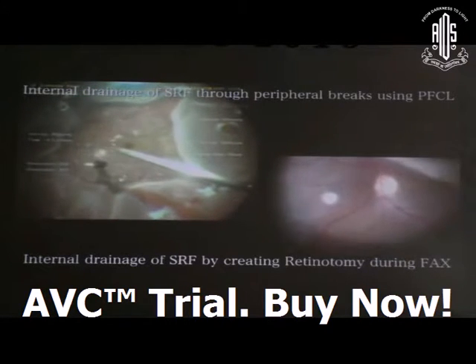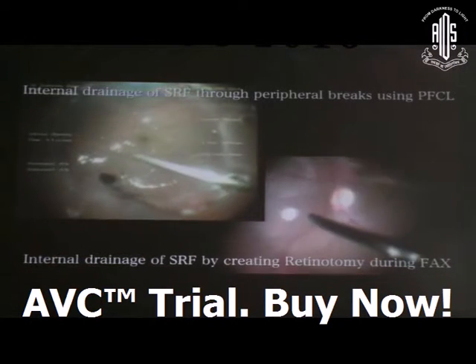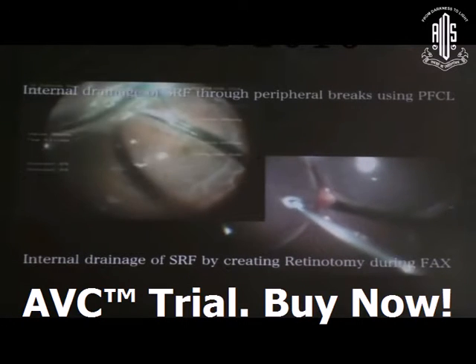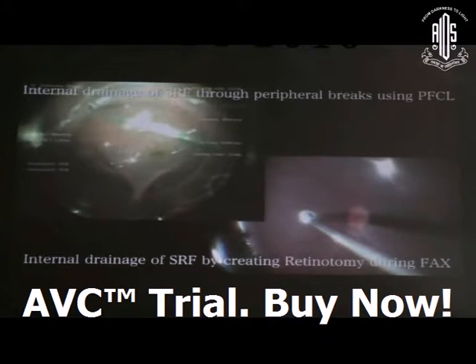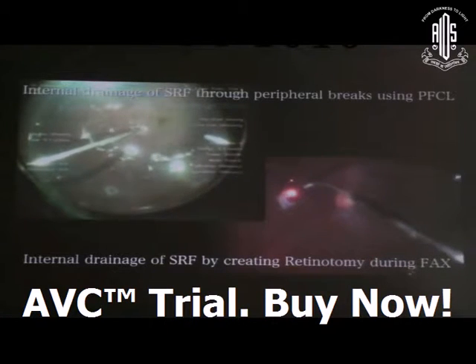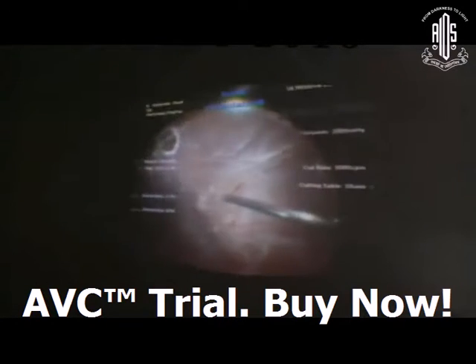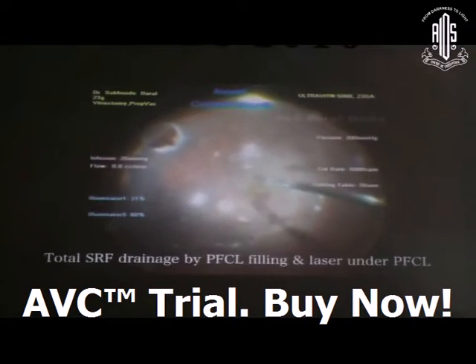With the help of PFCL, inject over the posterior pole and the whole subretinal fluid will steamroll out through the peripheral breaks. Alternatively, you can perform a posterior pole retinotomy — especially in the superonasal area or the most bullous area — drain all the SRF, and do laser around the retinotomy as well as the peripheral breaks.